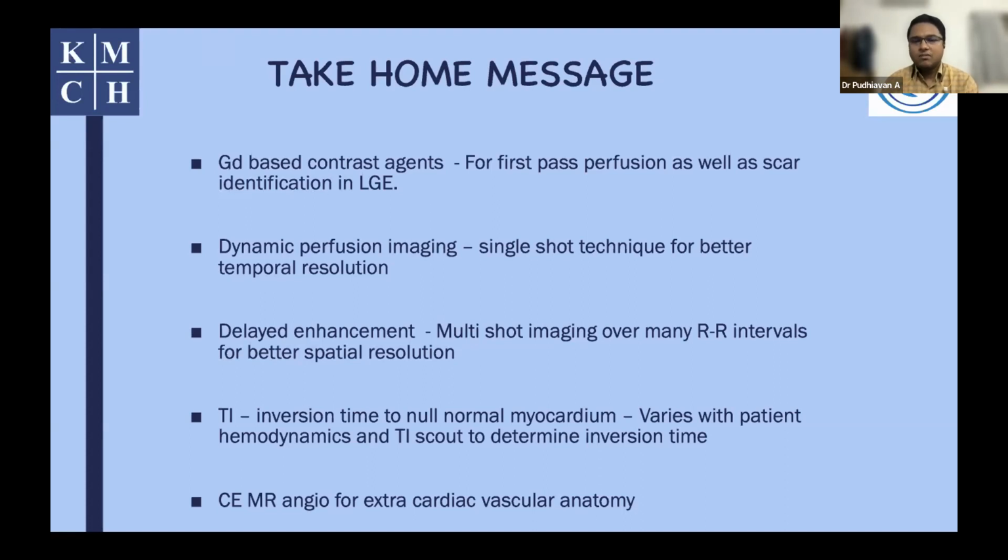So we can get away with using multi-shot imaging techniques over multiple cardiac cycles, which gives us better spatial resolution. And TI time, or the inversion time, is the time used to null the normal myocardium. This will vary from patient to patient depending on the patient's hemodynamics, and we can do a TI scout to determine the correct inversion time at which the normal myocardium will be nulled.